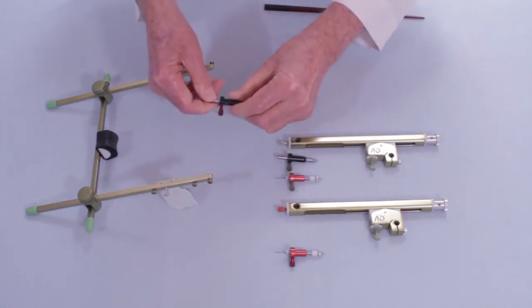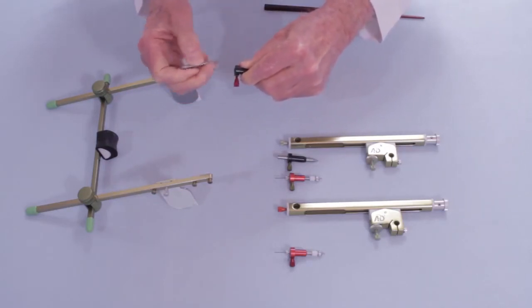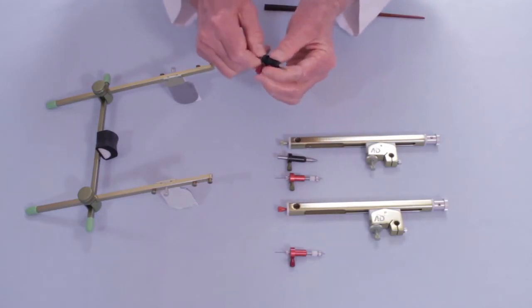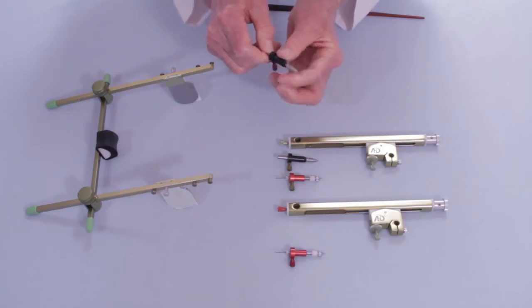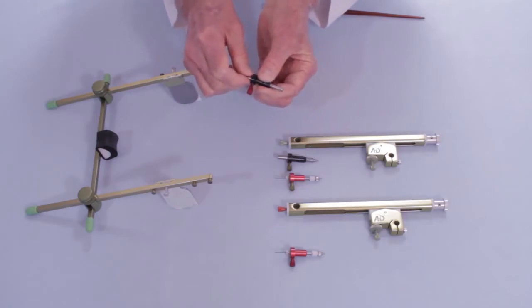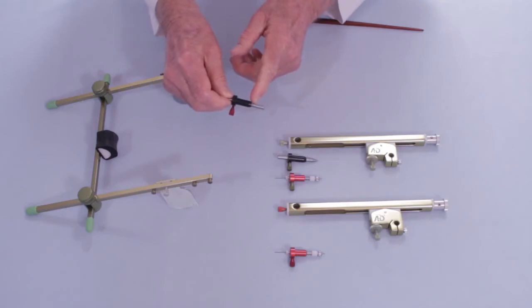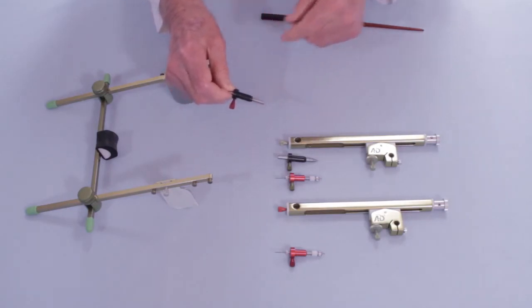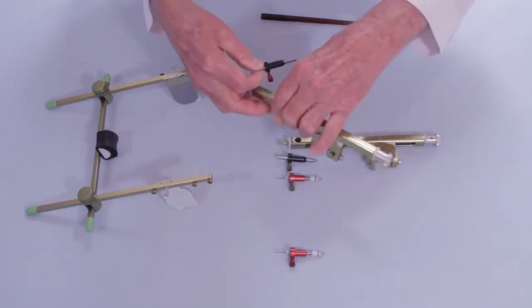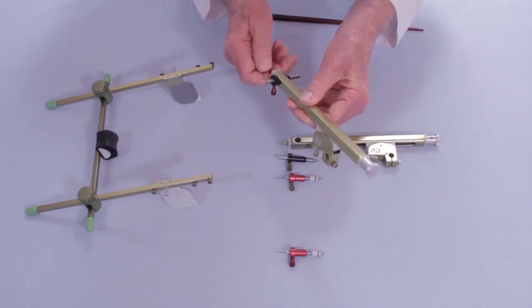And we set the stylus pen by setting it so that the flat side will be toward the flag, toward the patient, and we'll set it so that it measures approximately 2 millimeters. You can see here that we have approximately 2 millimeters of distance here marked on the stylus pen. Then when we set up the flag assembly for the right side, the stylus pen goes in, lock it in position.